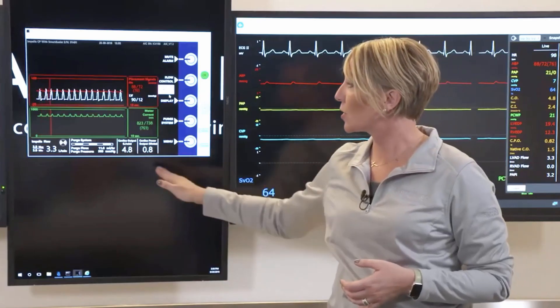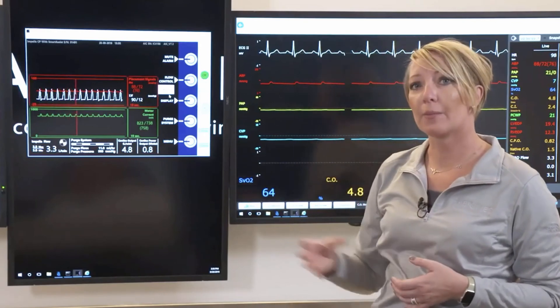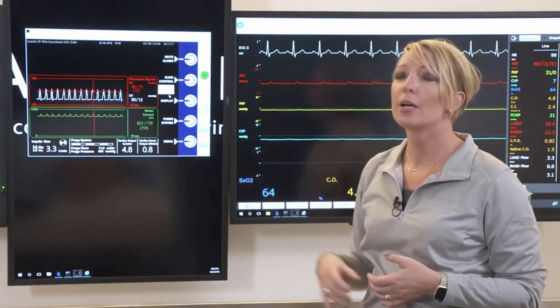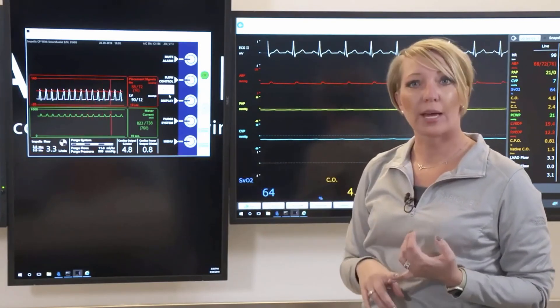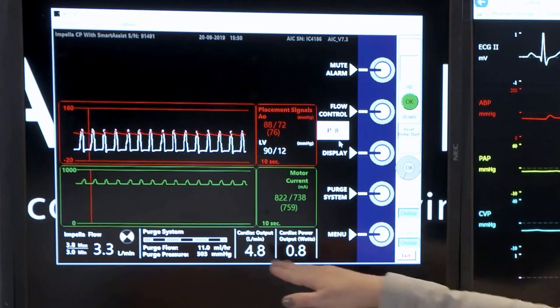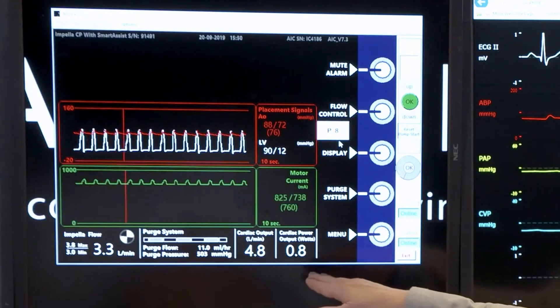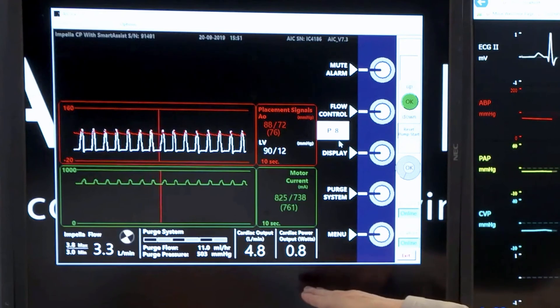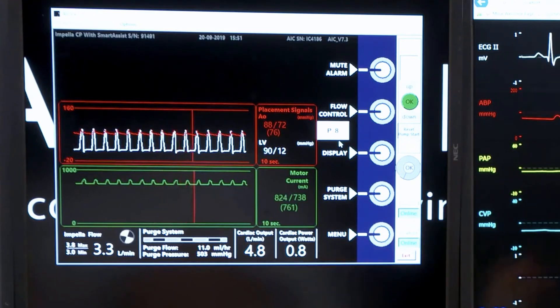On the far right hand of that common screen, we will have the additional metrics. That's going to be inputting the cardiac output, and then the AIC will automatically calculate the CPO to allow for trending of that CPO.